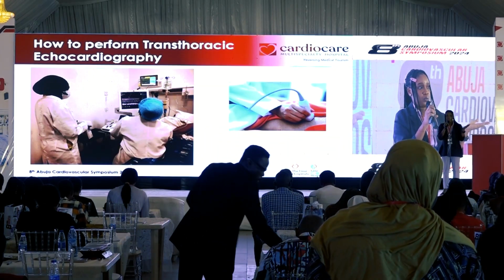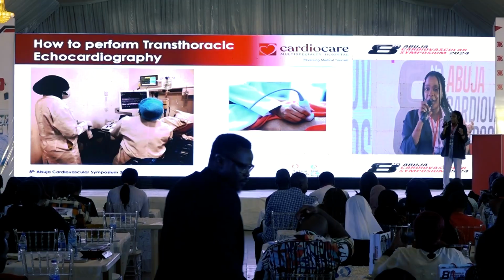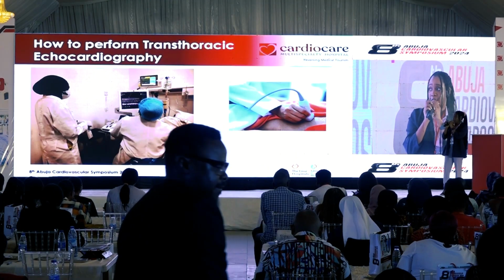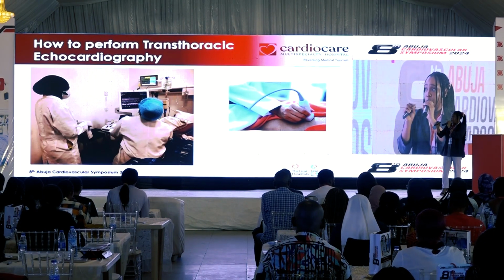It's very important that when they're lying on the bed, they lie on their left side. It just helps your image to be clearer. So sometimes you'll be having difficulty getting a clearer image. Just tell them to lie, put their hand under their head, and you will see that the image will become much, much clearer.